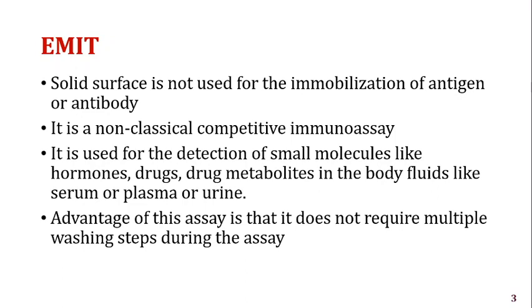Another advantage of this assay is that it can be directly investigated in the body fluid of the person, and there is no need of a series of washing steps during the assay, which you have seen in other immunoassays, like whether it is radio immunoassay or ELISA. It is necessary that in each step of the assay, the sample needs to be given a thorough wash. In this case, there is no need of wash.